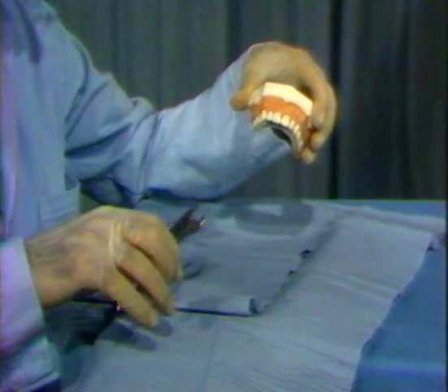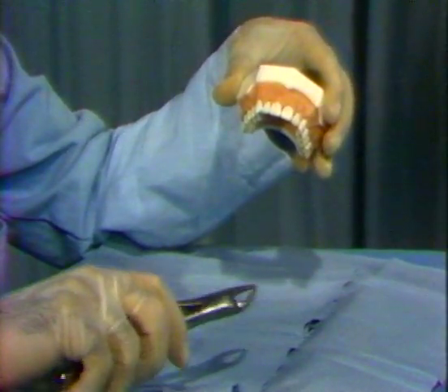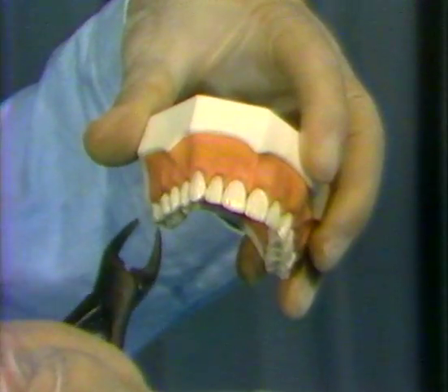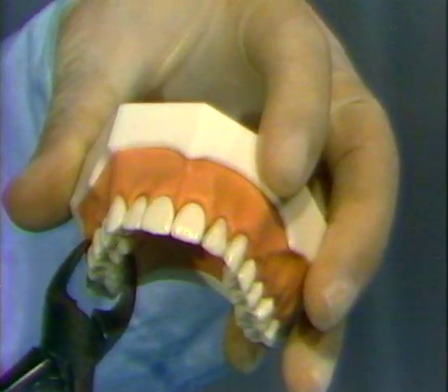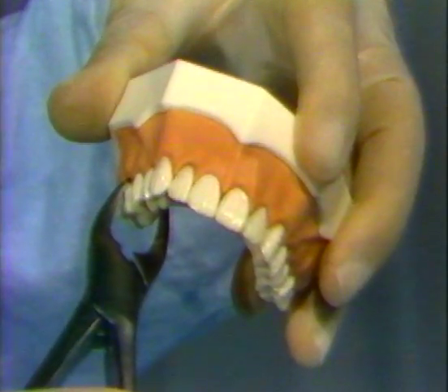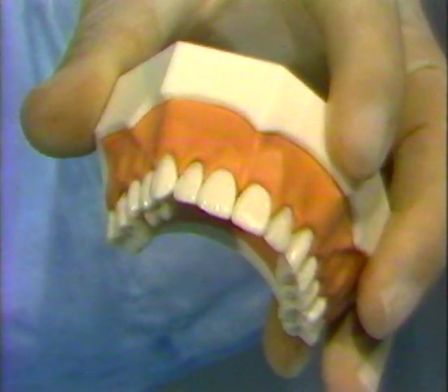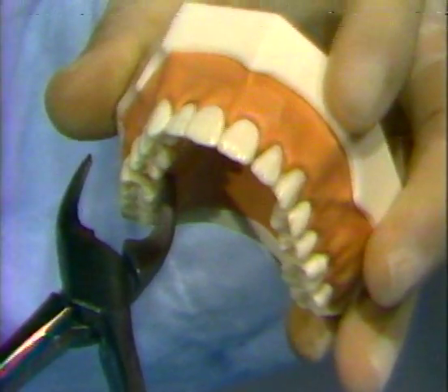Forceps are held near the ends of the handles in order to obtain the maximum mechanical advantage. In the application of the forceps, it is essential that the long axis of the forceps be placed parallel with the long axis of the tooth. To properly seat the forceps at the cemento-enamel junction, pressure is placed toward the root apex of the tooth. Once the forceps is properly seated, enough pressure is placed on the forceps handles to hold the forceps on the tooth without slipping. It should be noted that unnecessary pressure will fracture or shatter a weak or cariously undermined tooth. When placing the forceps, the palatal or lingual beak is placed first, followed by placement of the buccal or labial beak.